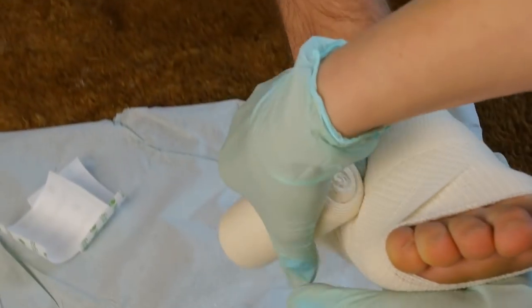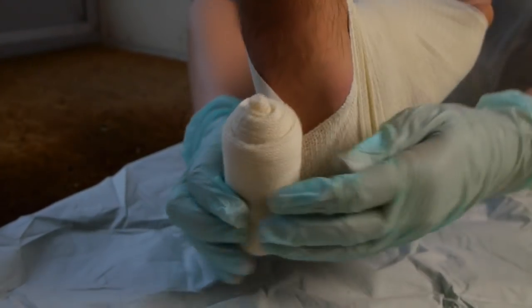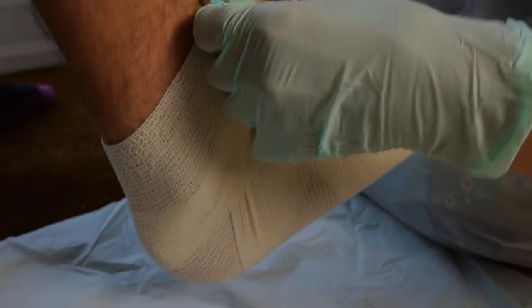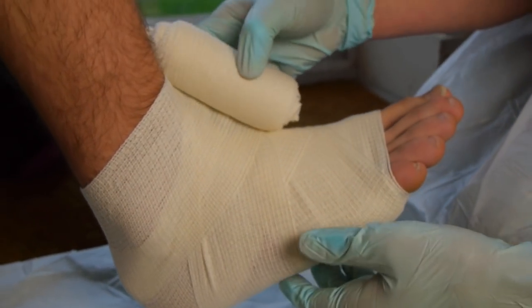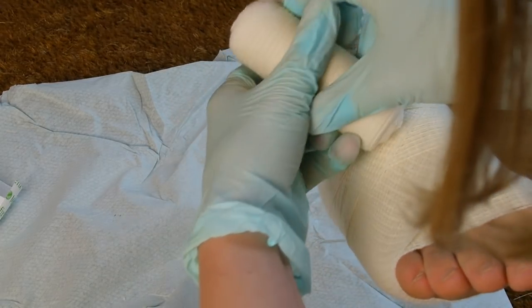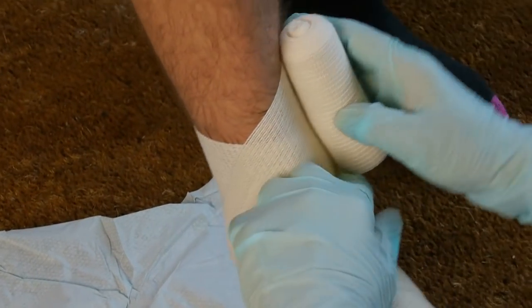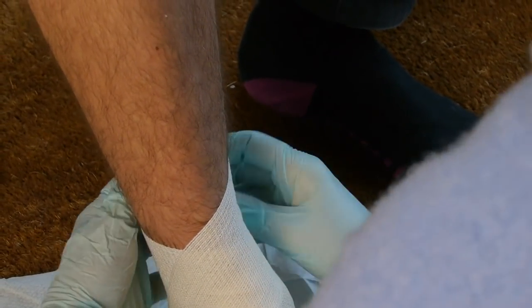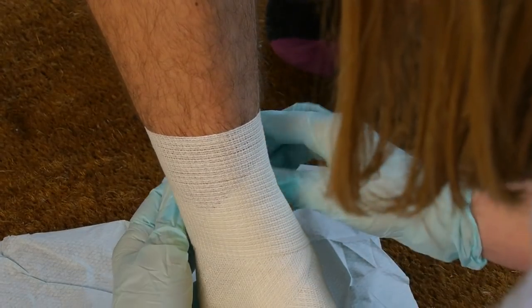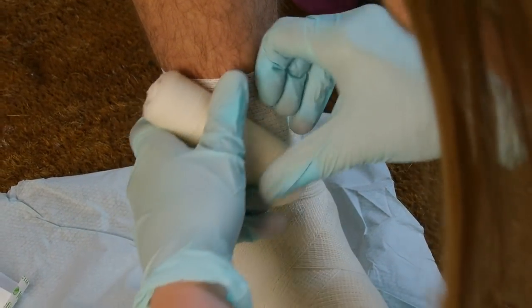Now then start bringing it round and back, round and back across. And again up, I want to bring it in an upward motion around the back of the leg.